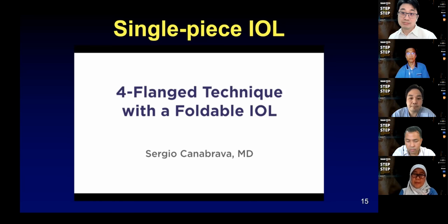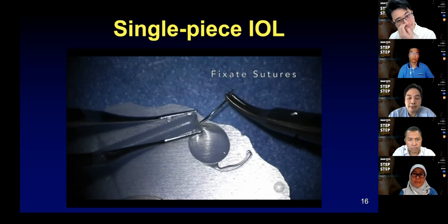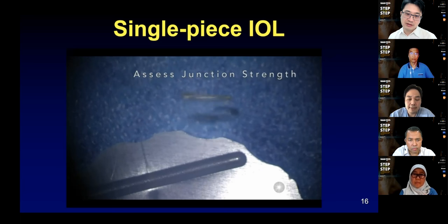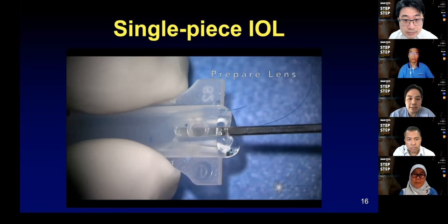So this is another technique that's shown, but rather than using an IOL punch, this surgeon just passes the needle of the 6-0 straight through again where the haptic junction is. So this is a SA6T lens, as they showed earlier. So it's a one-piece acrylic lens. And in this way, the surgeon does not truncate, does not chop off or amputate the haptics and just inserts it. But the difference here is he uses the actual injector.